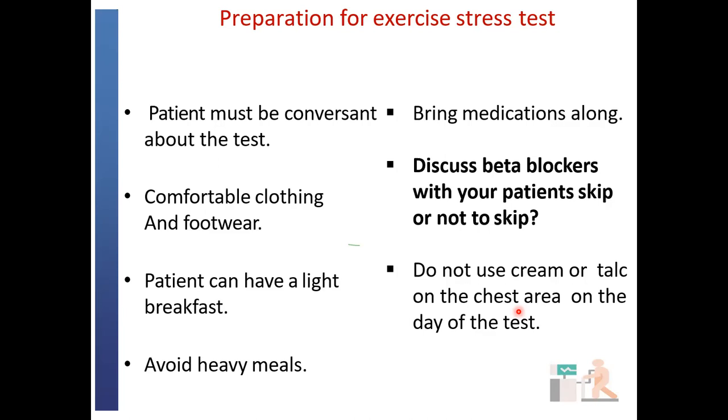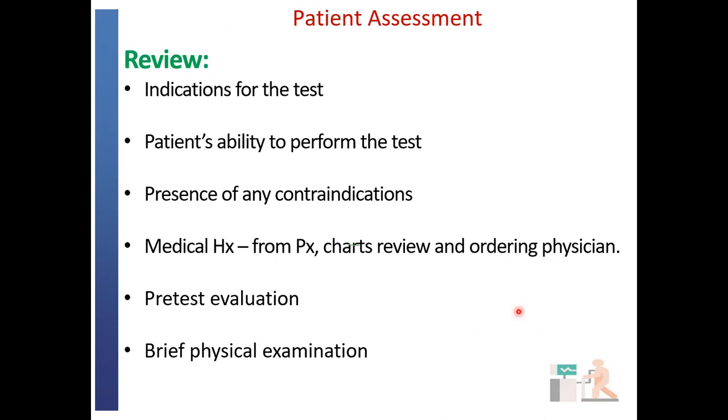Again, you should advise them not to use cream or talc on the chest area on the day of the test, because even though you're going to clean the areas where you're going to apply the electrodes, that can also have some effect on electrode placement. So your steps to review patient assessment include: you should review the indications for the test, review the patient's ability to perform the test, whether or not he has the capacity to do the test safely, and the presence of any contraindications to the test. At this point, this is the moment where we take a look and decide whether there is an absolute or relative contraindication or it is safe to conduct the test for this patient.